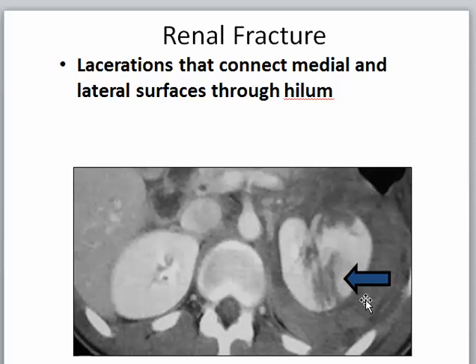The kidney being retroperitoneal, if there is collection limited to the retroperitoneum, it could be within the Gerota fascia, and in this case it will seep down to form the famous urinoma, because Gerota fascia is free down but closed laterally and superiorly. And if in the pararenal fat outside the Gerota fascia, it will bulge into the peritoneum like that, but it will not soil the peritoneum. If soiling the peritoneum, that means there is a communication between the kidney retroperitoneal space and the peritoneum, which is rare.